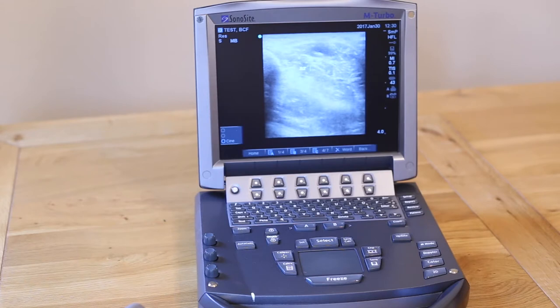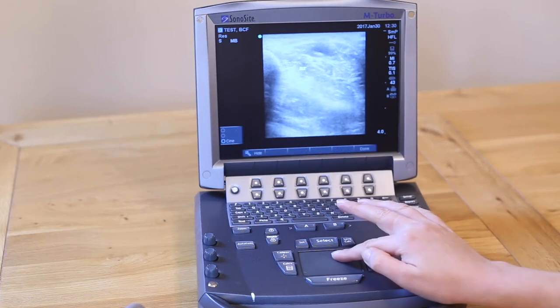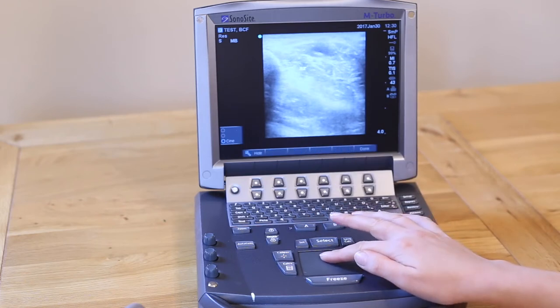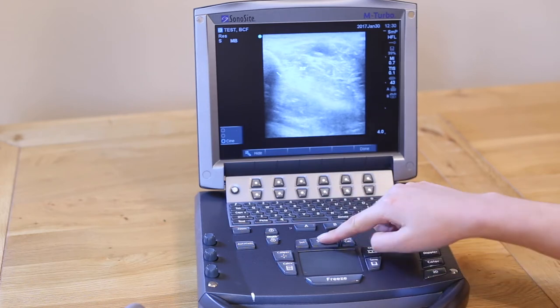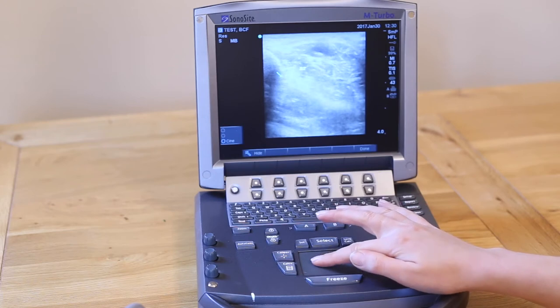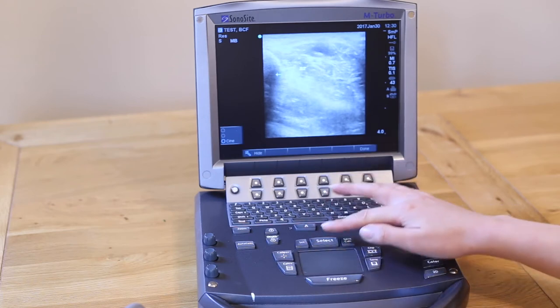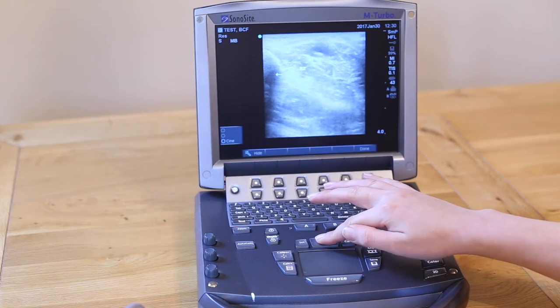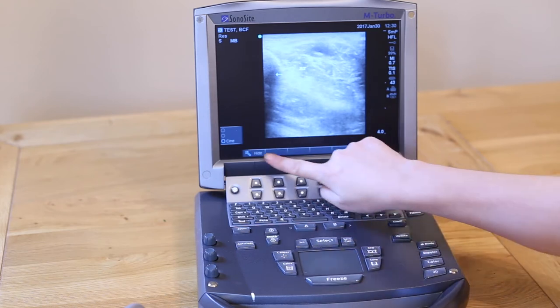You can also add in an arrow to your image. The arrow key is just to the left of the space bar on the keyboard. Move your finger over the trackpad to change the location of your arrow and press Select. If you then move your finger over the trackpad, it will change the orientation of your arrow. To get rid of the arrow, press the left-most soft key to hide it.